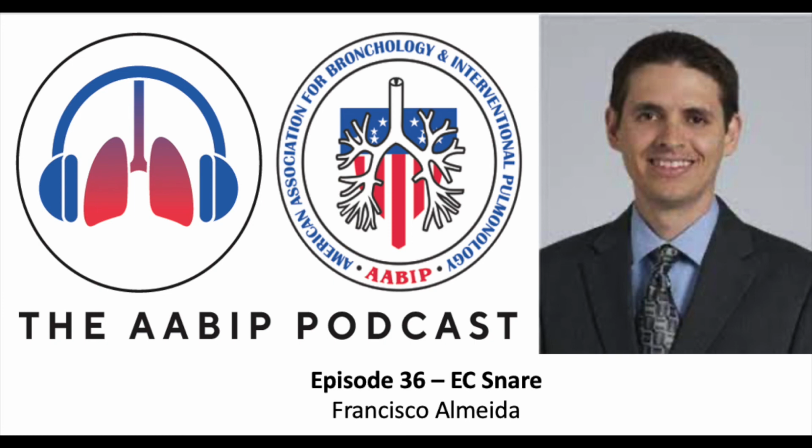So you mentioned lowering the FiO2, below 40% ideally. Are there any other precautions that you take, apart from having good communication and preparation, in terms of using electrocautery snare, some things our listeners should be aware of or be prepared for? I think we discussed most of the important things: the FiO2, your communication, knowing your other tools to be ready. One thing that we didn't discuss, or maybe we did, is making sure you have that snare around the lesion and it is tight before you start really using your energy.